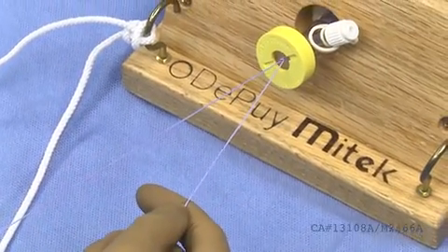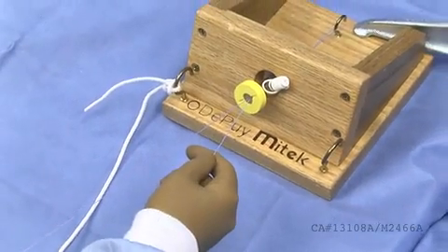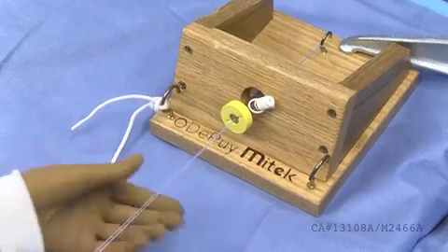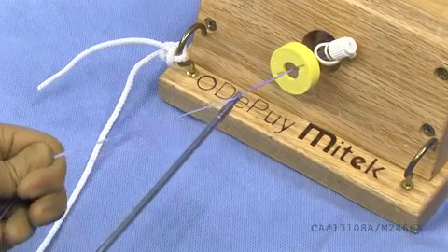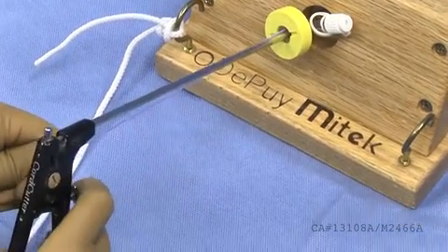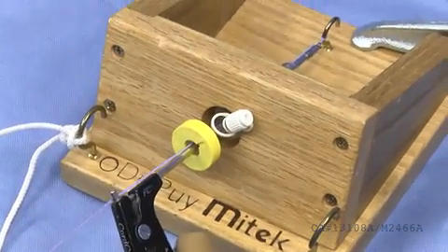Slowly dress the knot and pull on the post strand of the suture to slide the suture to the desired location. Using the cord cutter, place your sutures through the slotted distal end of the cutter, close the jaws of the cutter, zip line down to the knot, and finally pull the trigger to cut the suture above the knot.